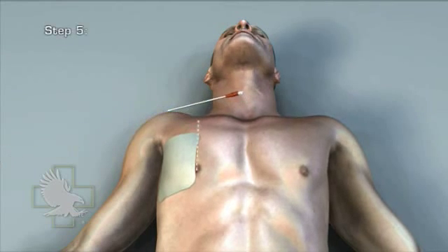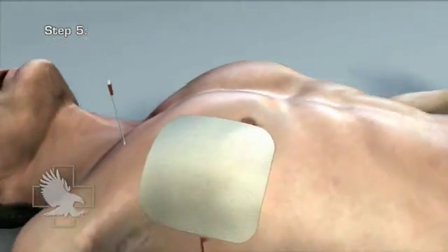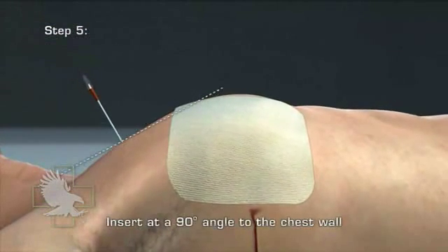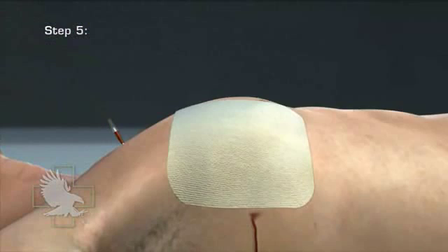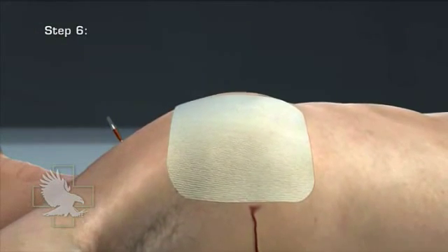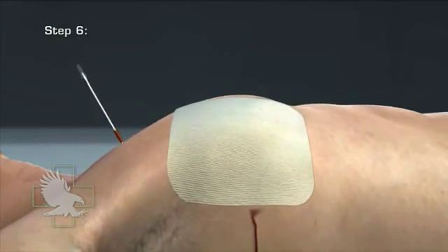Step 5. Insert the needle into the skin over the superior border of the third rib, mid-clavicular line, and direct it into the intercostal space at a 90-degree angle to the chest wall. An audible rush of air may be heard from the needle. Step 6. Remove the needle and leave the catheter in place. Consider securing the catheter to the chest with tape.